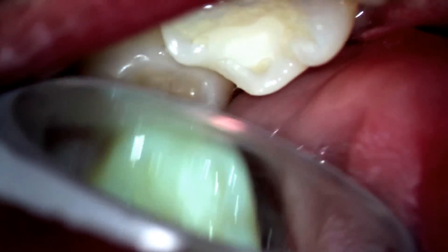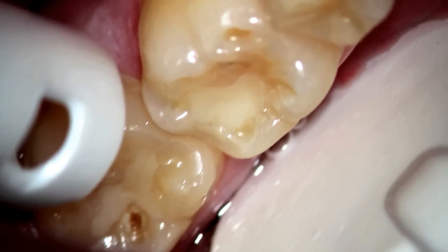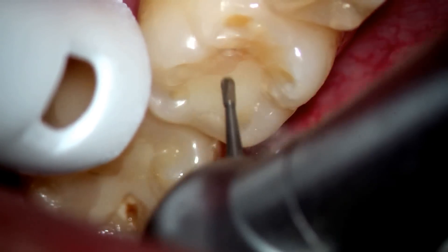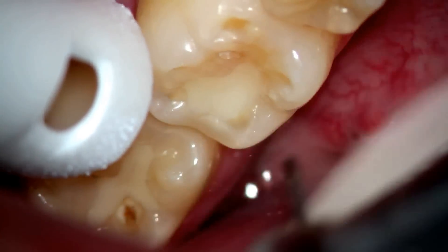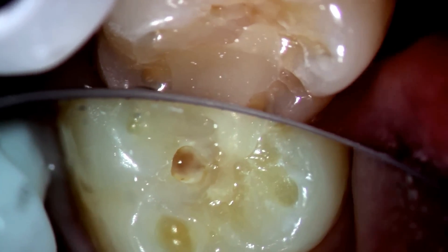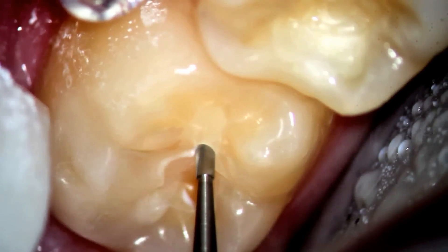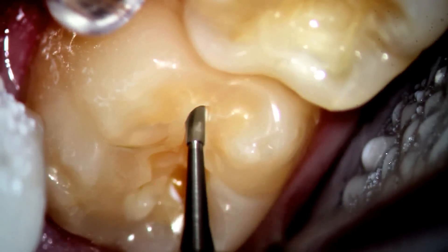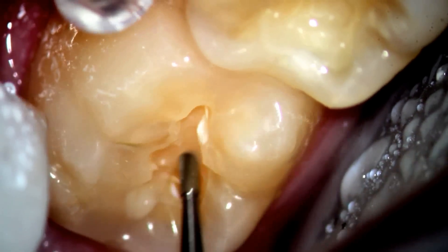The first molar also has that erosion, and we go ahead and remove the tooth-colored filling. As we start to do that, you'll notice the dark brown that's there and the softer decay that shows.